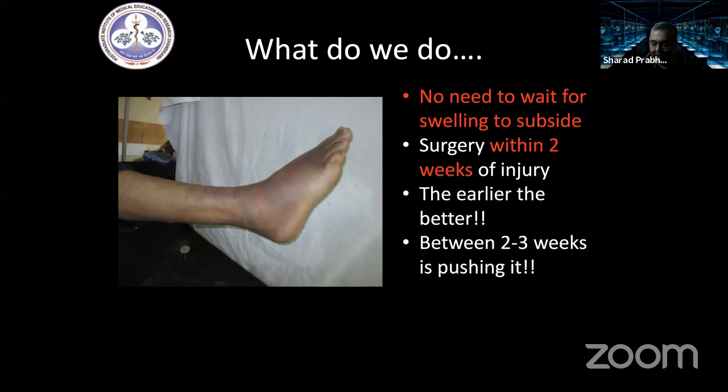The question regarding whether you can use regular plates or do you need to use screws or wires is entirely up to you and also dictated by the approach. In a sinus tarsi approach, like Dr. Sampat showed in an excellent presentation, you could use a radius plate, you could use a plate that's angled to the back. With the approach that we have evolved, you could use a conventional plate as well. So again, it is approach dependent as to what implant you can use. K-wires and screws for sure, you can use with any approach, I guess.